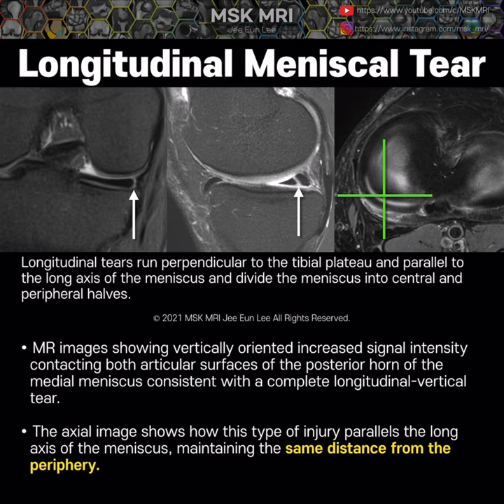This MR image shows a vertically oriented high intensity line contacting both articular surfaces of the body and posterior horn of the medial meniscus, consistent with a complete longitudinal vertical tear.